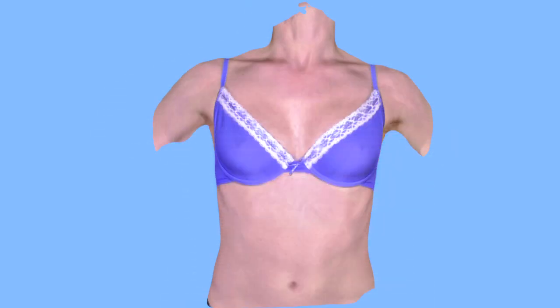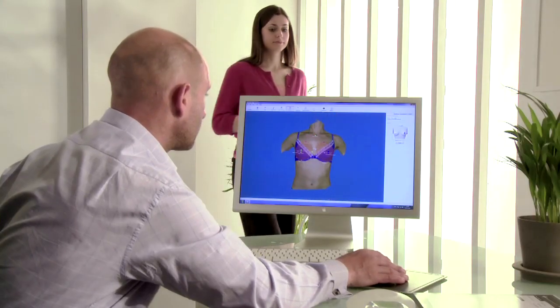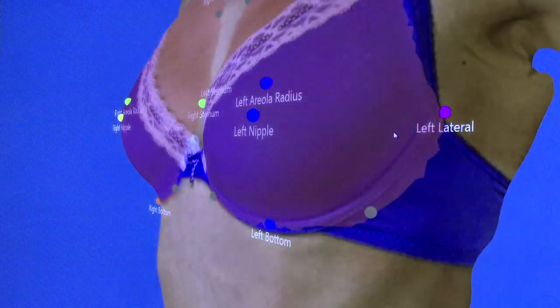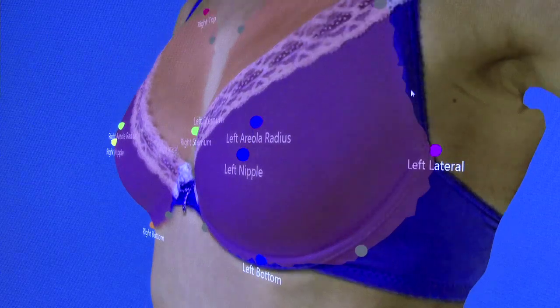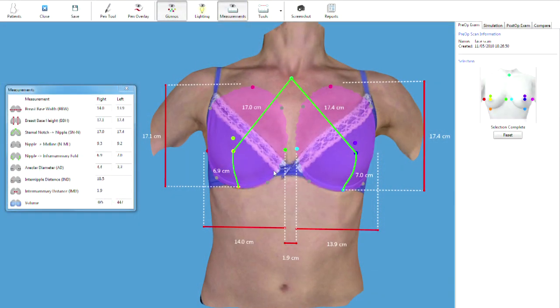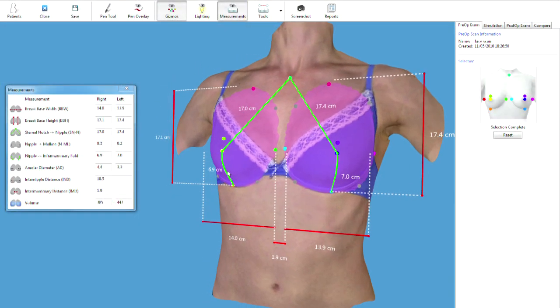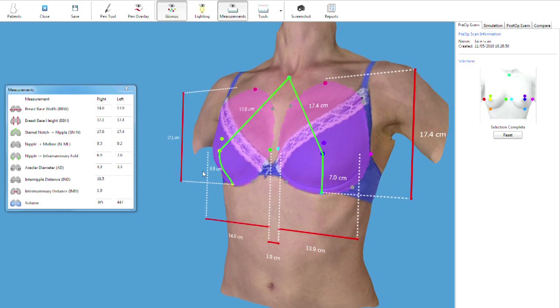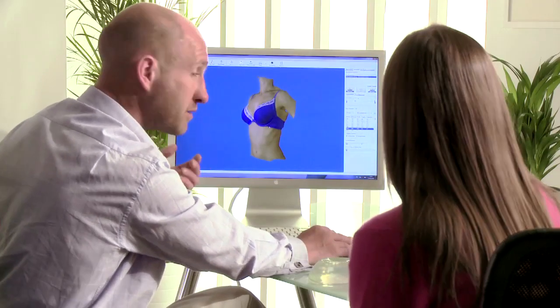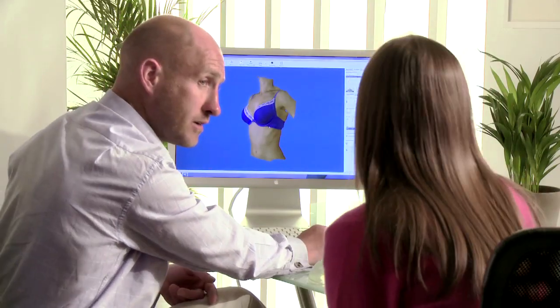In the time it takes your patient to get dressed, you can easily select key landmark points to indicate the breast tissue. The system automatically generates industry-standard measurements such as base height and width. Volumetric measurements are also calculated to enable analysis and discussion of symmetry.